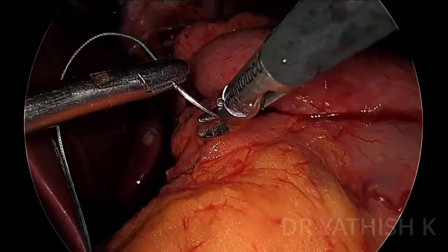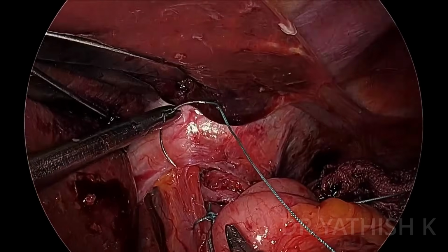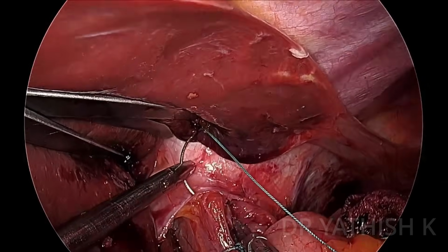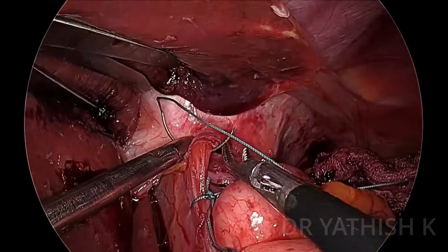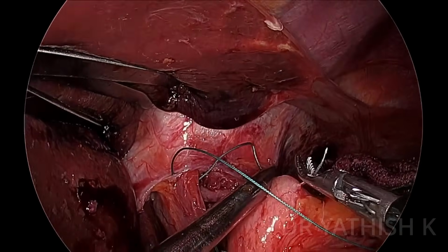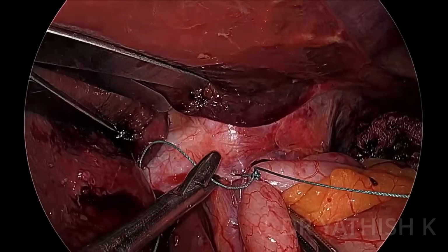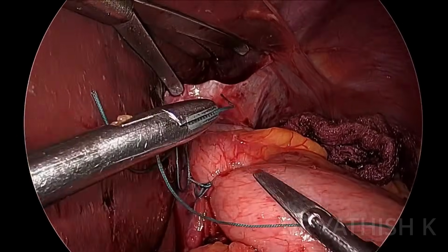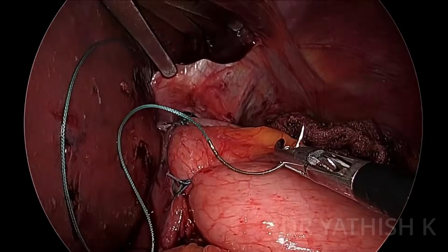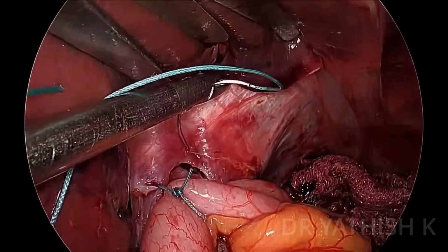So now that the wrap creation is almost done, the fundus is secured appropriately to the edges of the myotomy site, and I'm going to take a few anchoring bites to the hiatus and to the fundus to prevent it from disrupting. So these are a few tips on how to create an anterior Dor fundoplication wrap.